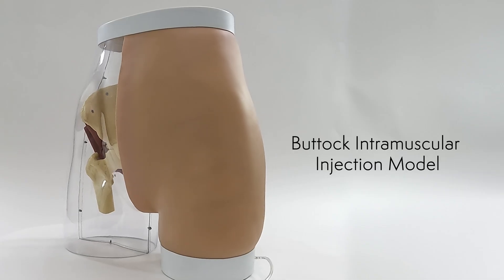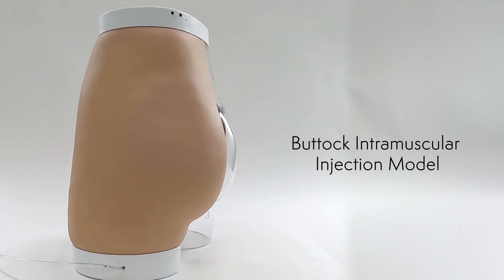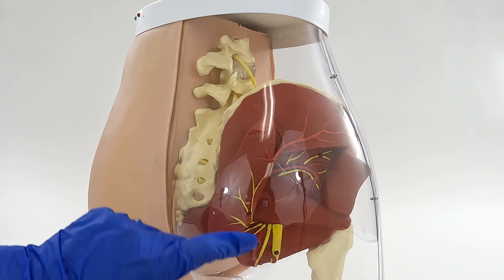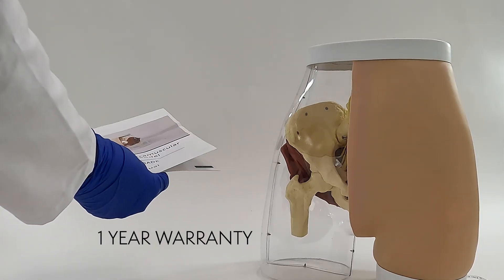Your buttock intramuscular injection simulator comes complete with essential components for a comprehensive training experience: one buttock intramuscular injection simulator, one screwdriver, a two milliliter syringe, an operation manual, and a generous one-year warranty.